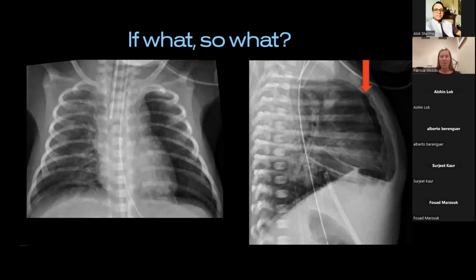It's very likely to go away on its own, or if you know about it and the baby deteriorates, you know the steps forward to go for. Okay, so again, defining when it's next to the sternum, or the same when they're nursed prone and the vertebrae, it can be a slither, and that's fine, but you've got to put it into context.